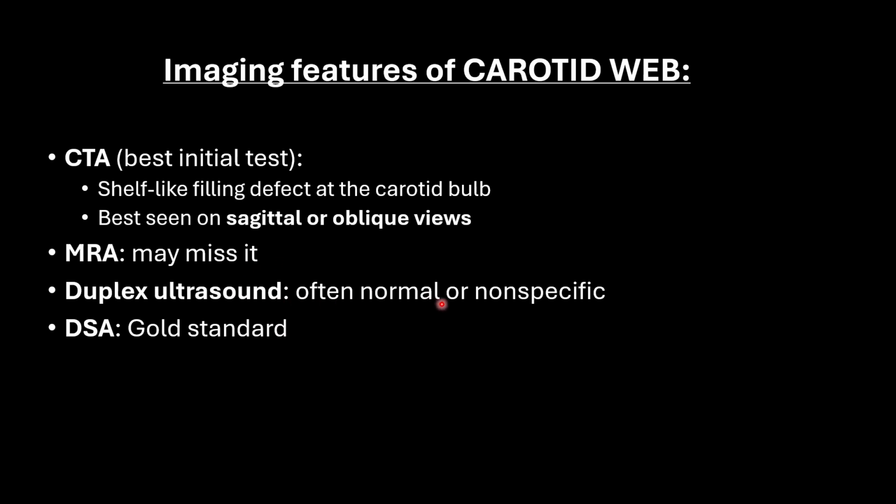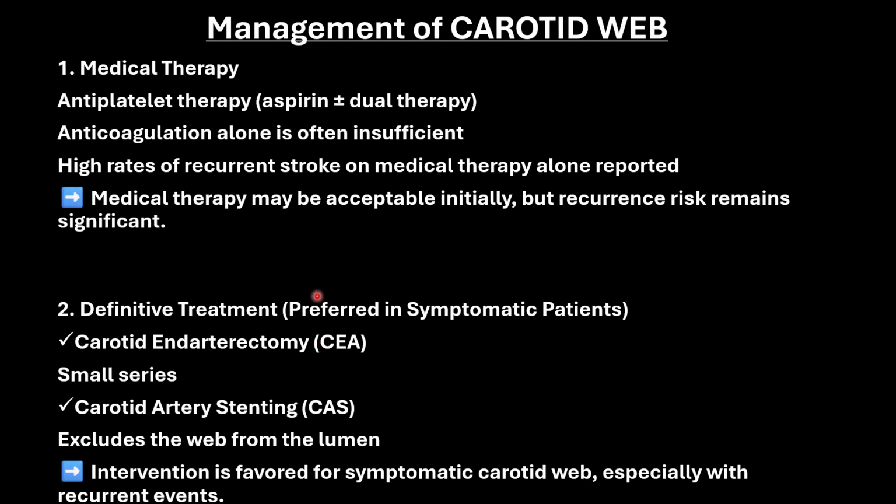Duplex ultrasound can be normal and non-specific. Only on retrospective imaging, on a second look, will we be able to see the shelf. DSA is supposed to be the gold standard. The management includes medical therapy and definitive therapy.